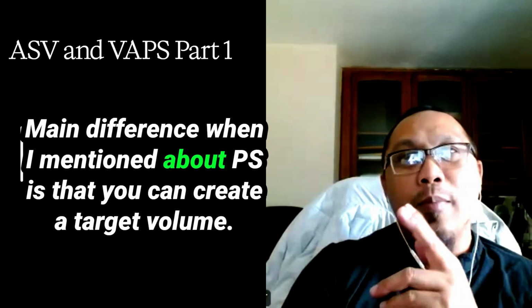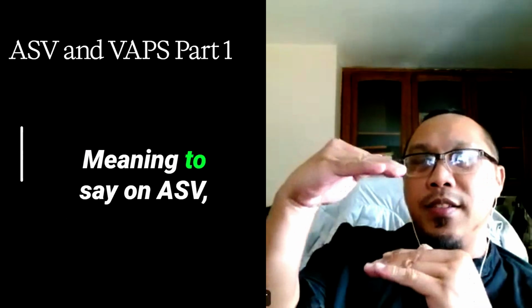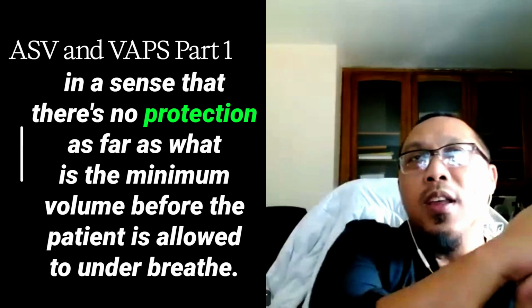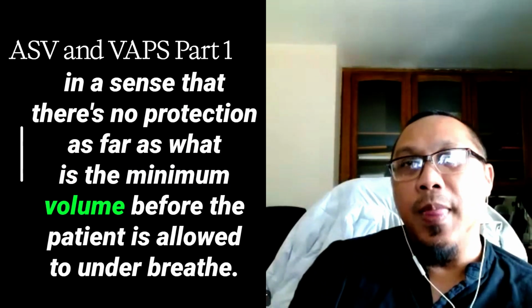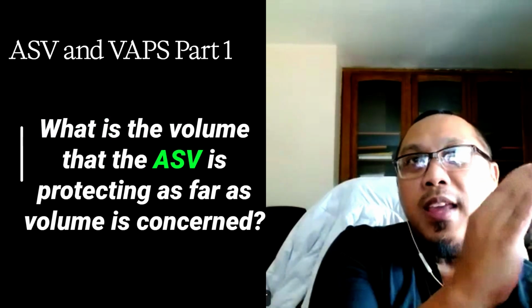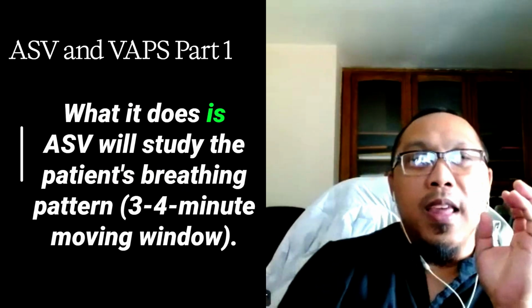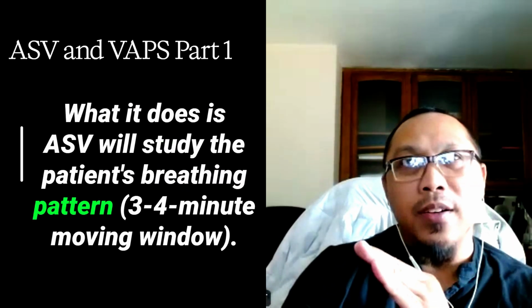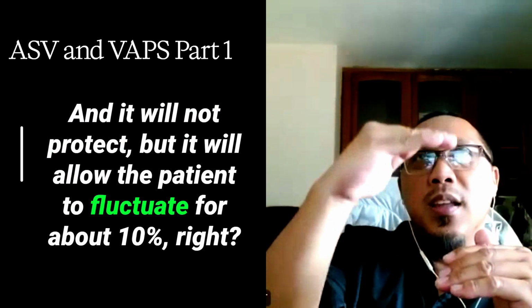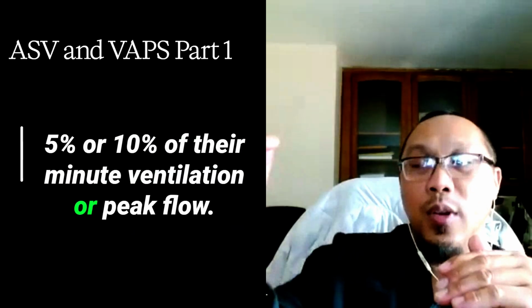The main difference, when I mentioned pressure support, is that you can create a target volume. On ASV, there's no target volume, in the sense that there's no protection as far as the minimum volume before the patient is allowed to underbreathe. What is the volume that ASV is protecting? Nothing. What ASV does is study the patient's breathing pattern, and it will not protect, but it will allow the patient to fluctuate for about 5 or 10% of their minute ventilation or peak flow.